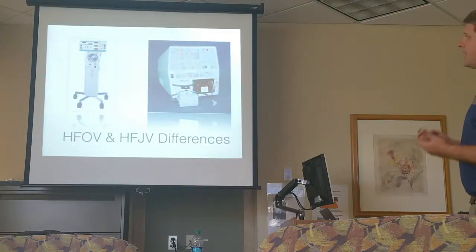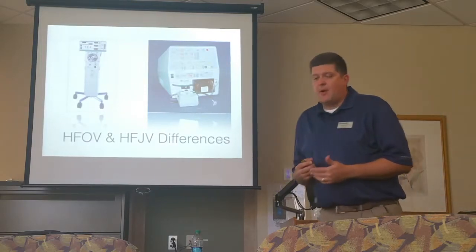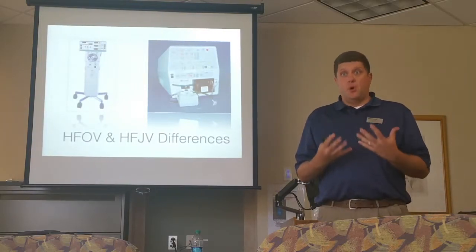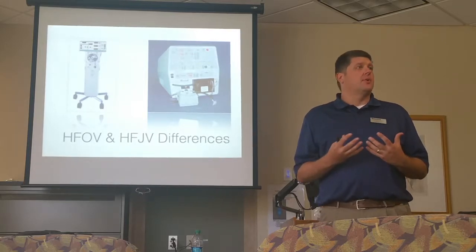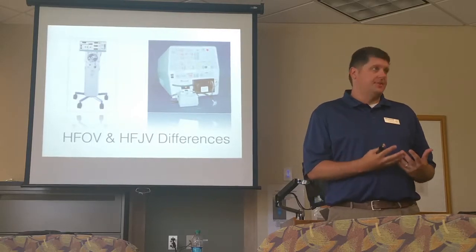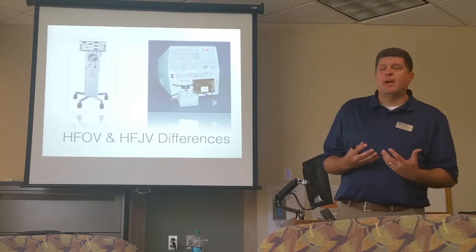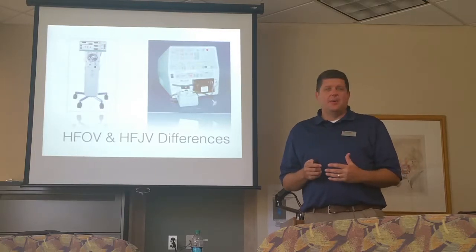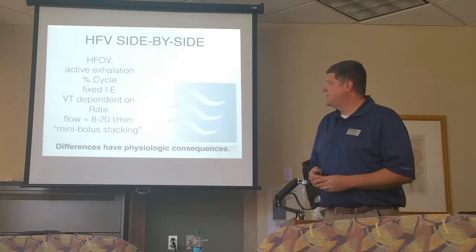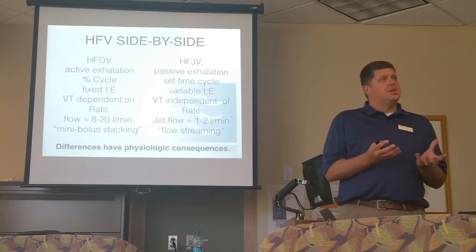So when we look at differences between an oscillator and a jet, I believe that every hospital needs both machines. Some patients will respond better to one or the other. It really just depends on the disease process that you're taking care of. What will help us decide which one to take out of the closet depends on the baby, the disease process, but also our knowledge of mechanically the differences between the machines.